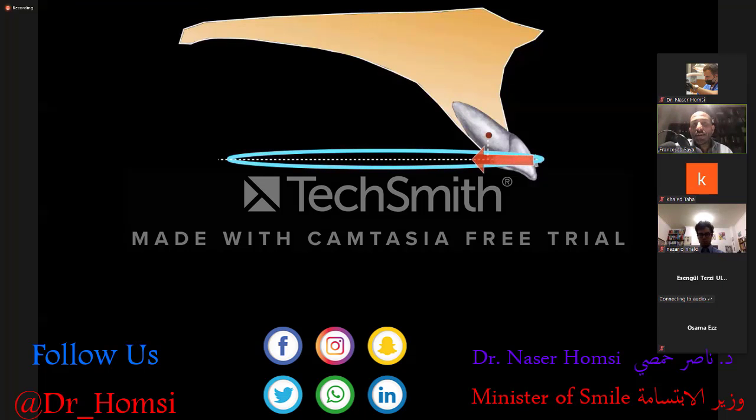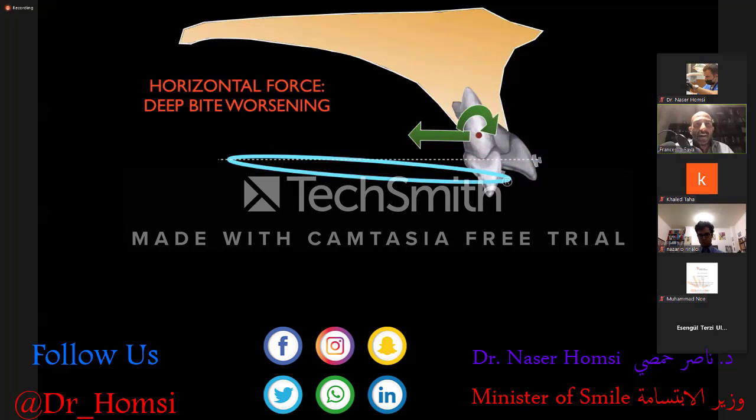If we used something like a continuous arch and a power chain, or a class 1 elastic, in order to retrocline the upper flared incisors, then during the retraction the gingival margin of the incisor will tend to go downward, and a pure horizontal force would tend to worsen the deep bite and make the overbite worse, and that would be opposite to the treatment goal for our patients.